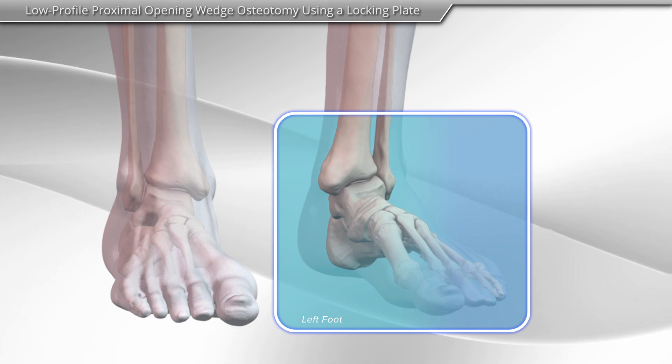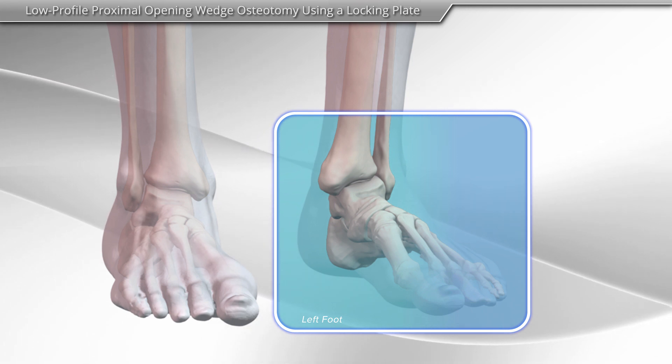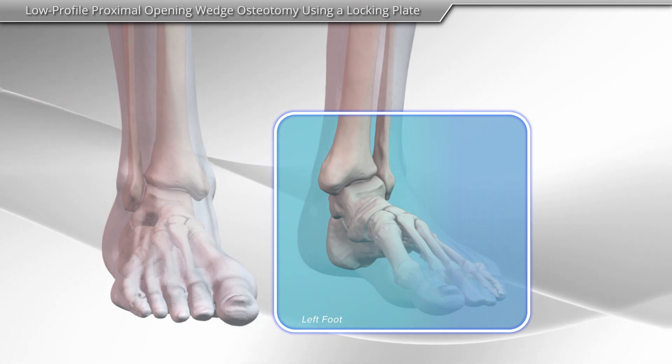In this animation, we will demonstrate the proximal opening wedge osteotomy procedure using a locking plate.